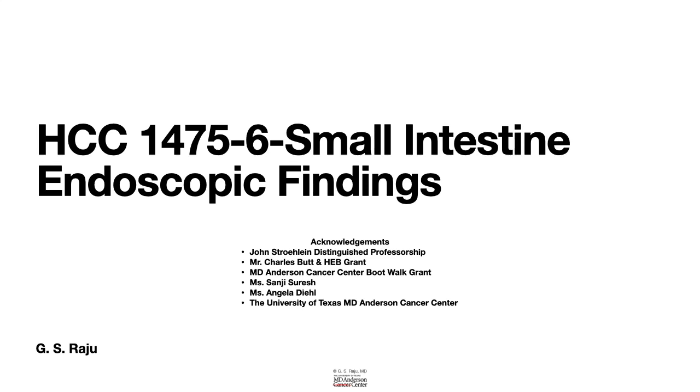Greetings. Let us learn about the endoscopic findings that we see in the small intestine.